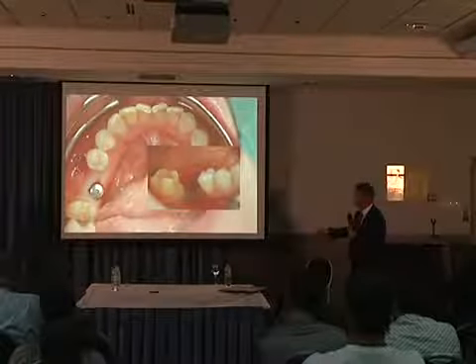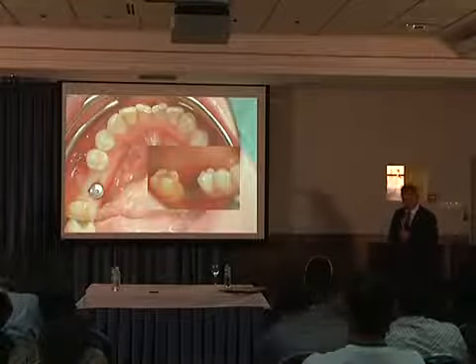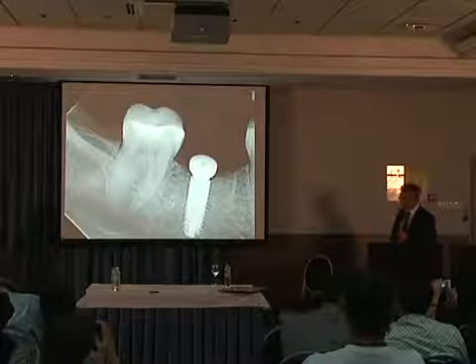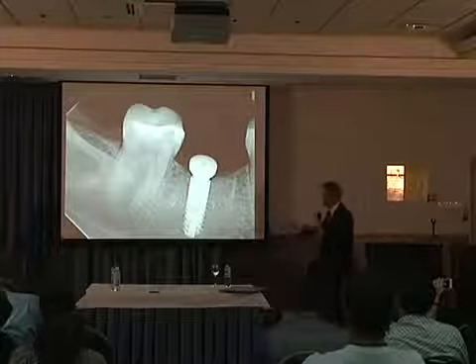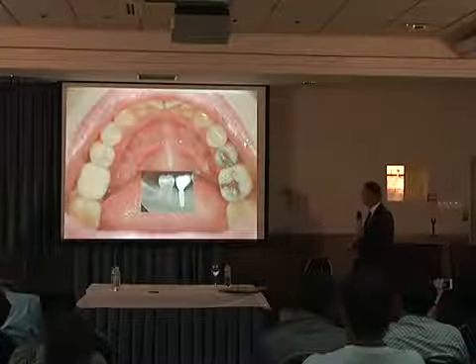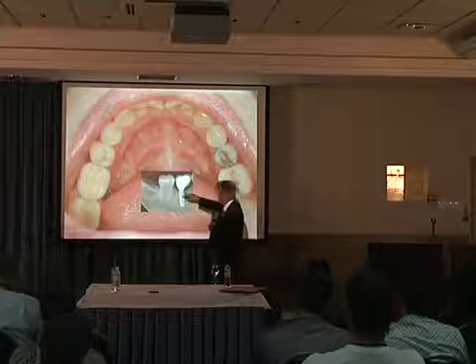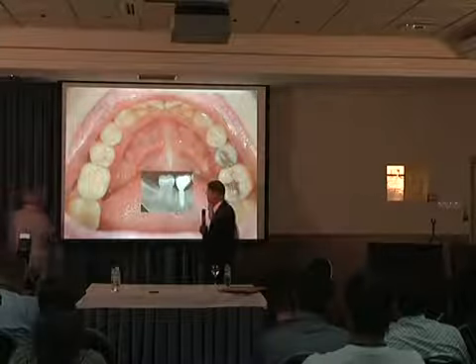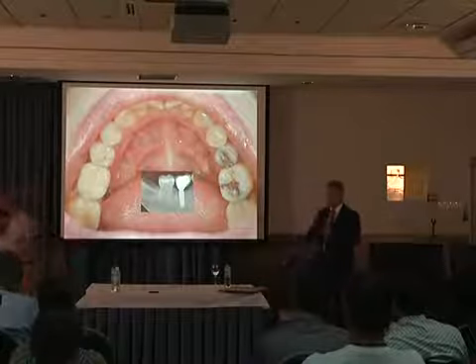Вытаскивается заглушка, или как мы ее называем, защитный колпачок, и ставится формирователь десны. Control X-ray. Контрольный рентгеновский снимок. Final restoration from referring prosthodontist. И, наконец, окончательная реабилитация пациента с изготовлением керамической коронки. Platform shifting.